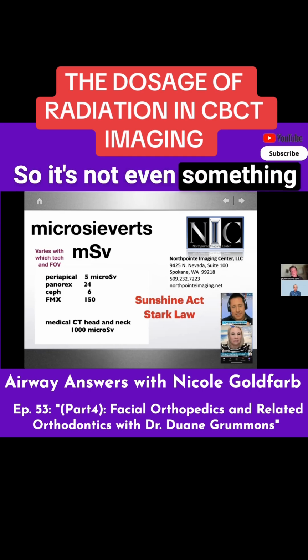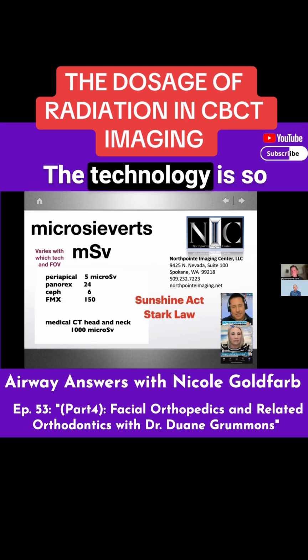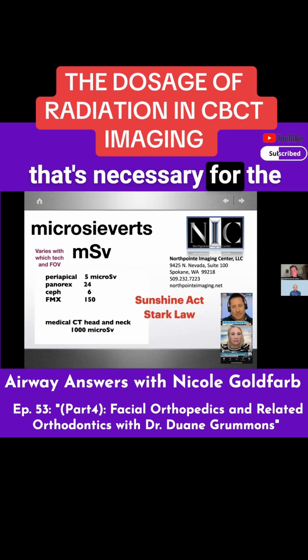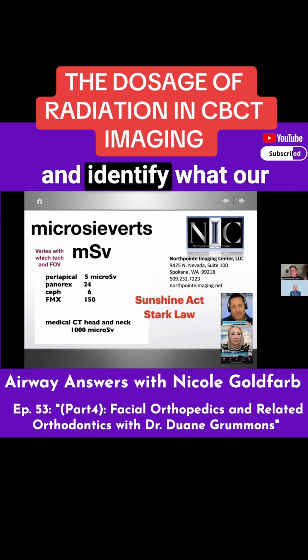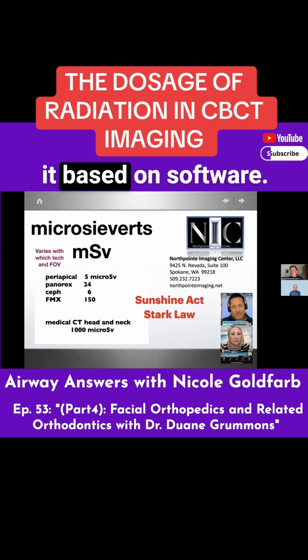So it's not even something where we kind of, sort of think there's too much. The technology is so good, and there's such a minor, limited signal that's necessary for the software to recognize and pick up the attenuation and identify what are dark and light objects, and we can colorize it based on software.